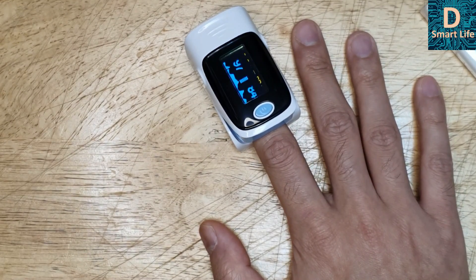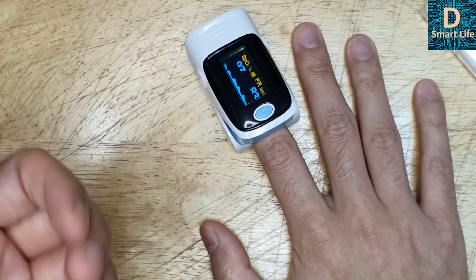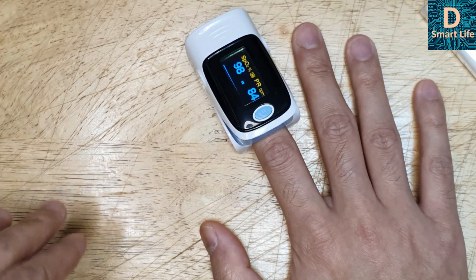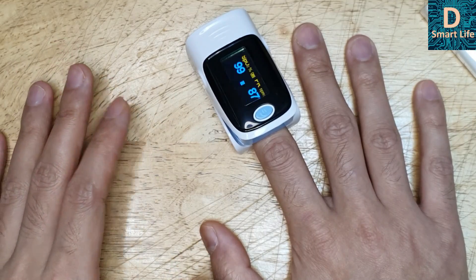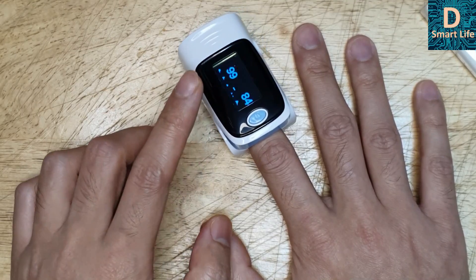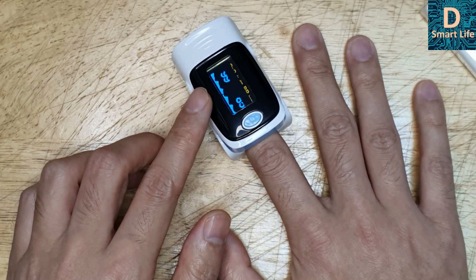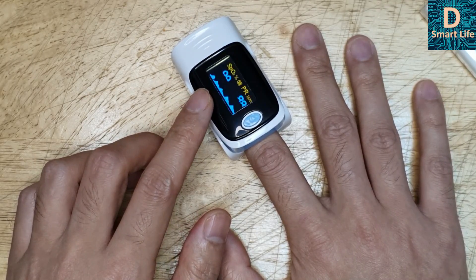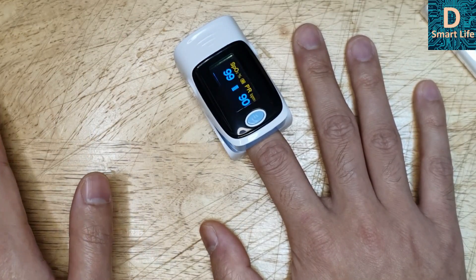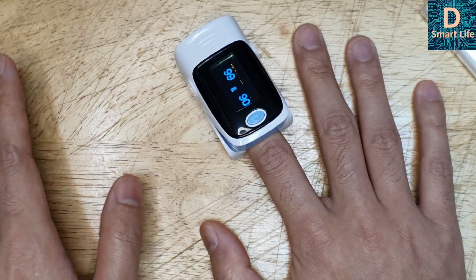So that was the test. As you can see, the numbers went below 93 — around 93. That was the lowest I could get, and I had to stop because I was getting dizzy. So that is the level where it hits 93 and you feel uncomfortable. My reading is normally always 99 or 98. But if your SpO2 is around 96 or 95 constantly — when you are not moving — then you may have a problem with your lungs, possibly pneumonia or COVID-19. That's how you can detect it.